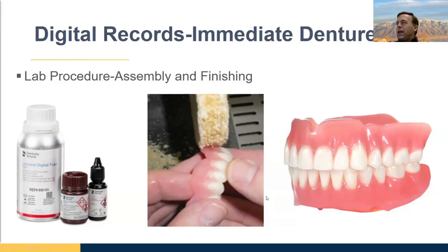So once we've basically broken off the little fences and stuff, we'll actually put the teeth and the base together with bonding resins before it goes into post-curing. One of the cool things about this is that during the heavy-duty cure, when this is finished, the two materials are being bonded together. So if you break one of these or cut through it with a disc, you're not going to see any seam. It essentially becomes one material.